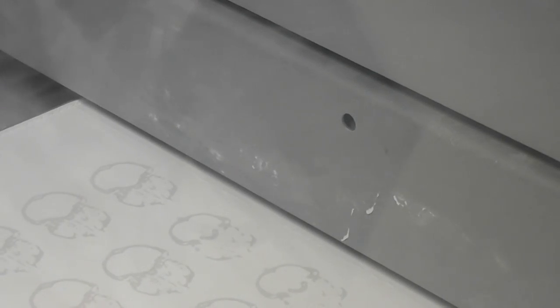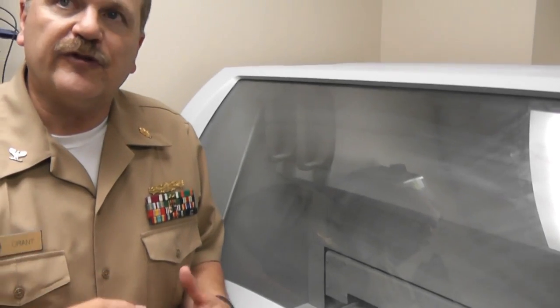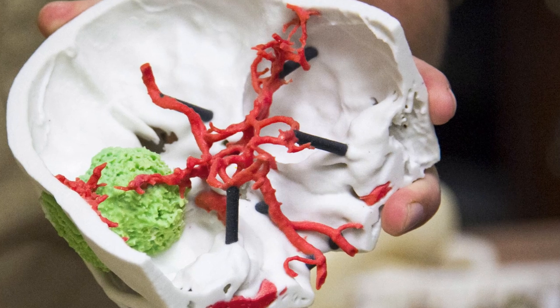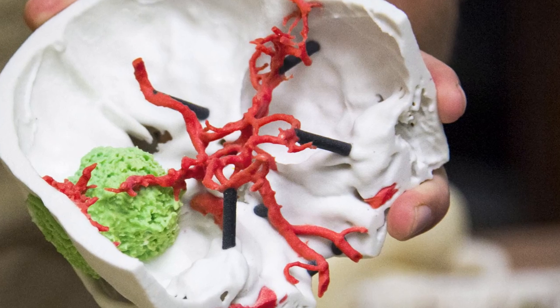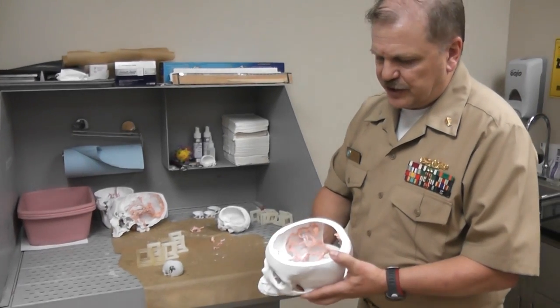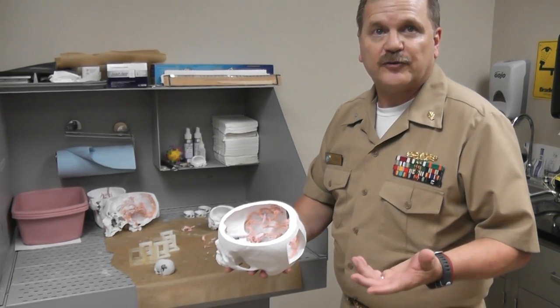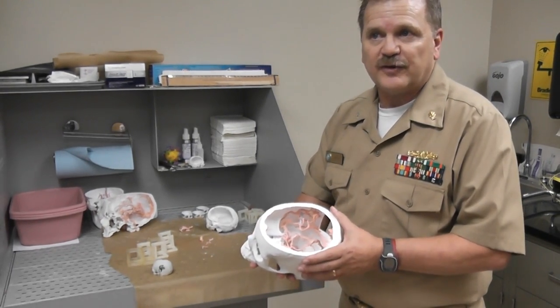These are really helpful because a lot of times surgeons want vascular models so they can see if there's an aneurysm or something. If we get the right kind of image, like a CT scan that has contrast showing the arteries and veins, then we can actually separate out those arteries and veins and color them a different color. It'll come off the machine like this — kind of like a green glaze on ceramics — so it's relatively fragile.